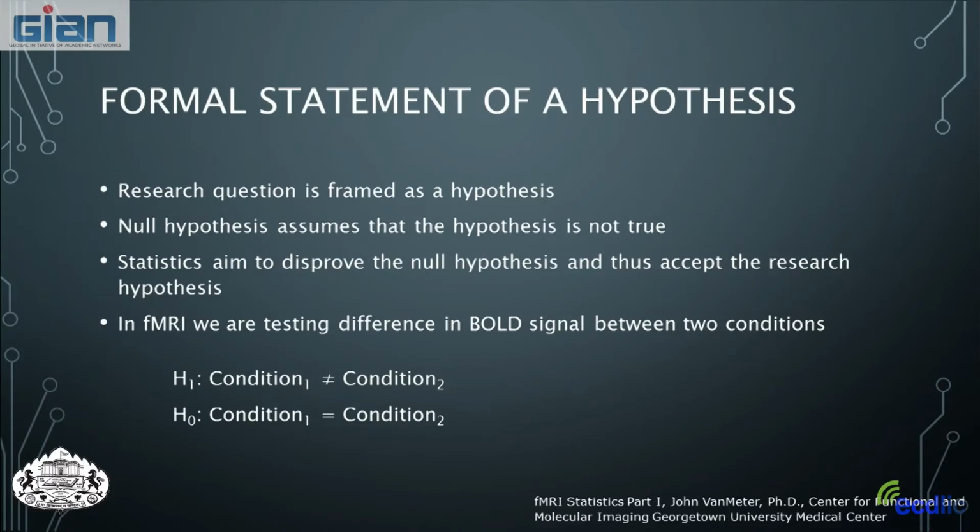And we're going to say that is the hypothesis that we're interested in, H1, okay? Our null hypothesis is that there is no difference in a voxel when we're looking at these, okay? So we're trying to test, is there an actual difference in these? We're going to be testing our beta values for these, our model fits. Are these beta values the same when we're looking at two different conditions, or are they not the same?